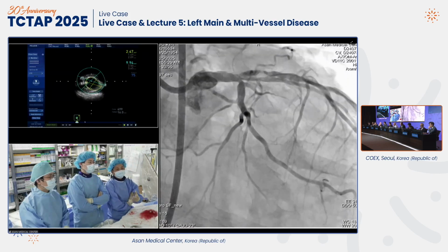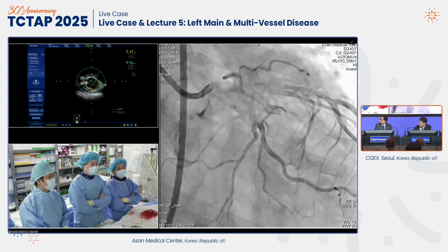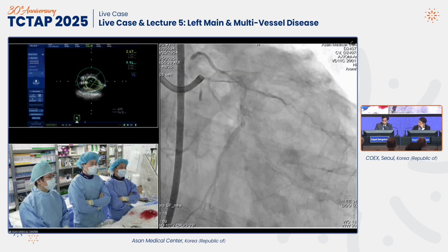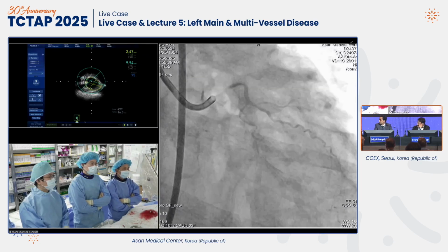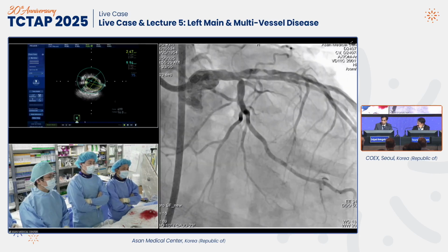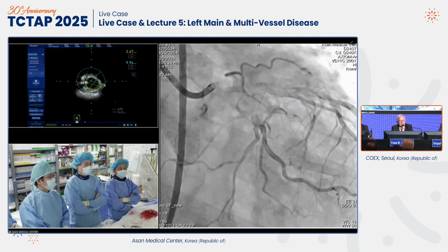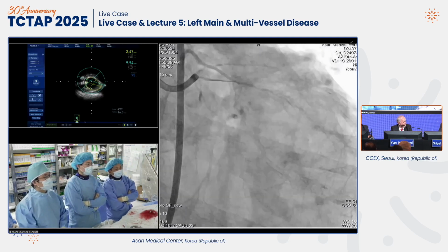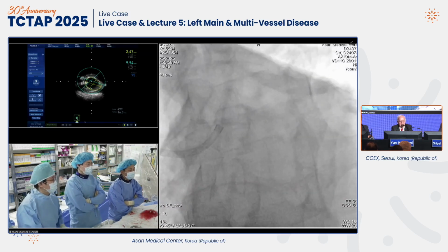How does the panelist think? All right, Dr. Louvard, what do you think of the IVUS findings? I will analyze that as I would do in France. In France, we don't use intravascular imaging. So we use QCA guidance, knowing that QCA is undersizing, but we can make some correction for the diameters.